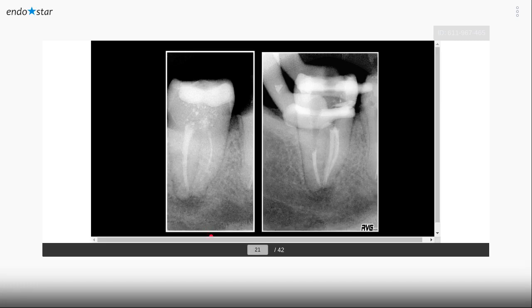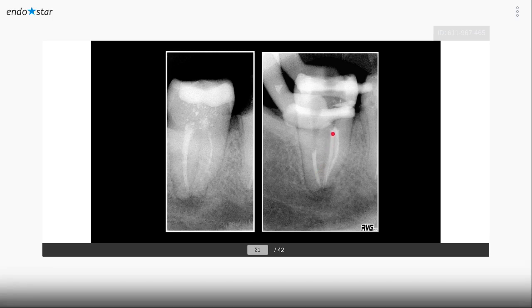So what we have is our preoperative X-ray, and we have our post-operative X-ray. And as you can see, I've done the mesial system, distal system, and I prepared already the place for the post. Then I referred to the prosthetic dentist, who gave me a good restoration with a post and crown. So this is the idea. And one more time, we're making X-ray, we're making measurement of the canals. Then we make the access, doing primary shaping, confirm the length, and after that we're making enlargement.